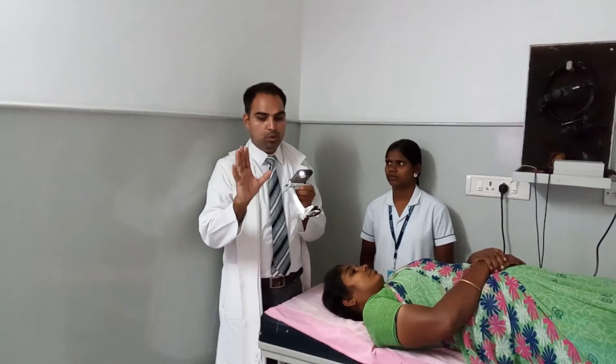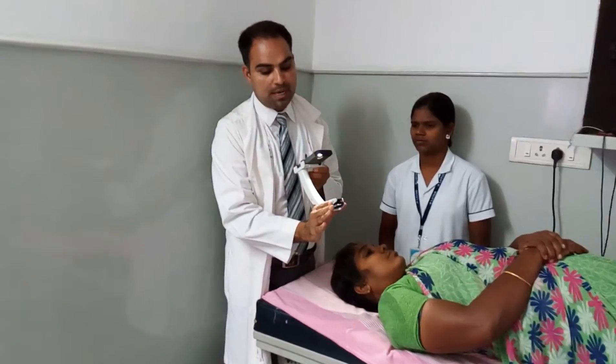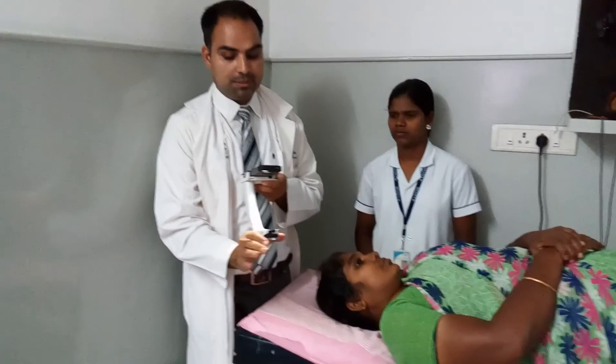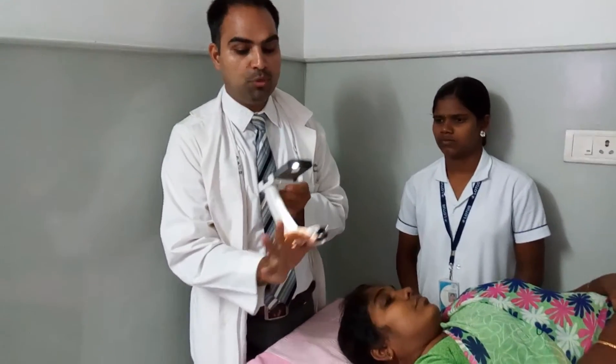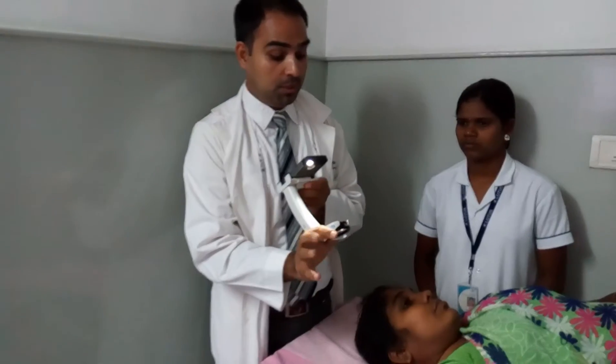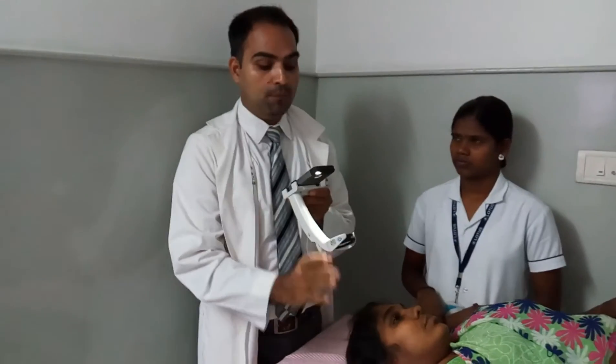For example, if you are a dominant right-hand user, you need to hold the 20D lens like this — between the thumb and index finger — so that you have three fingers free to take support from the patient's cheek or forehead.